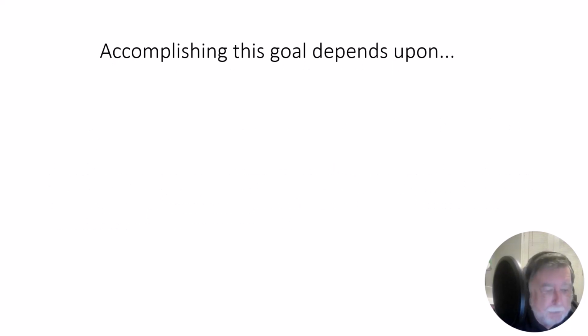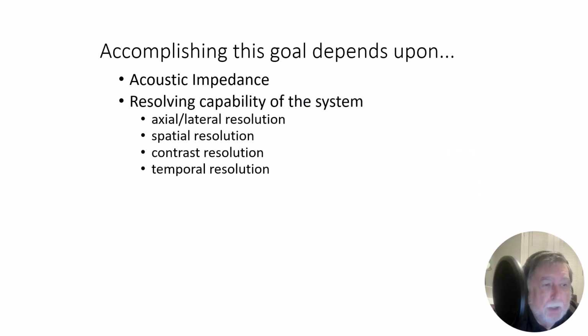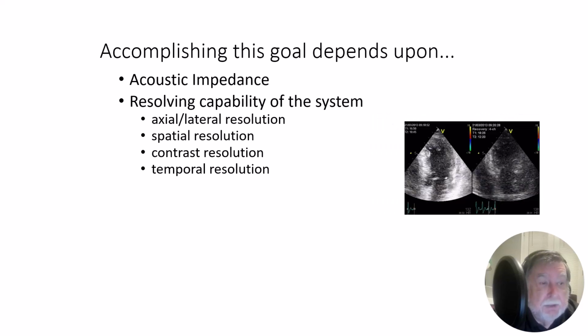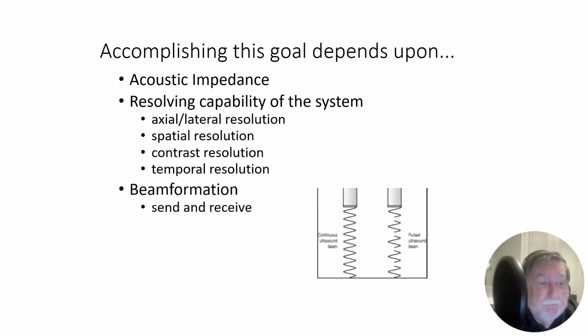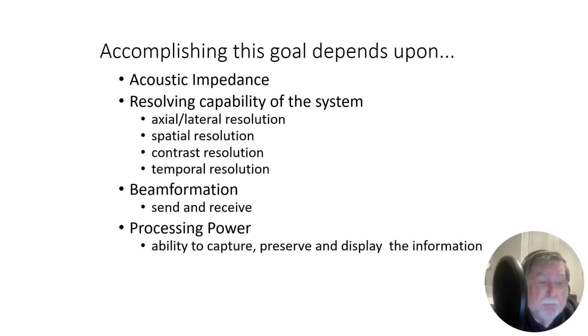Accomplishing this goal depends upon acoustic impedance, resolving the capability of the system, whether it's axial or lateral resolution, the spatial resolution, the contrast resolution, and the temporal resolution. This is the image itself. Beam formation, the ability to send and receive the ultrasound signal. And processing power, and that's the ability to capture, preserve, and display the information.